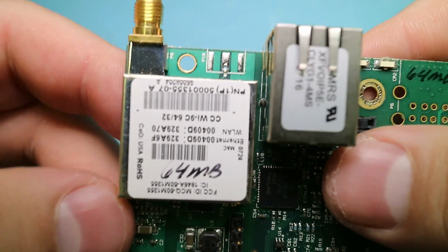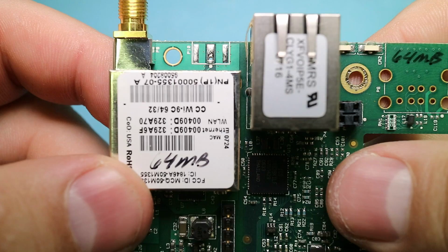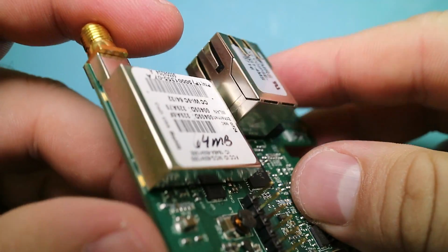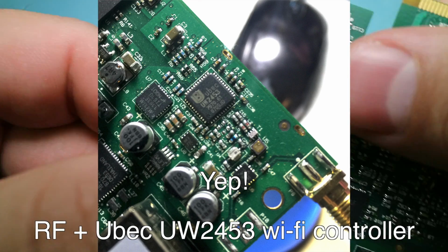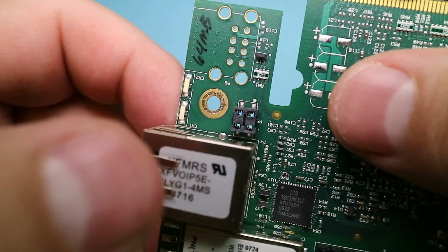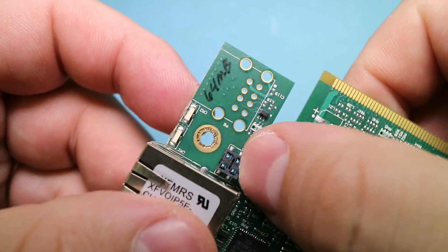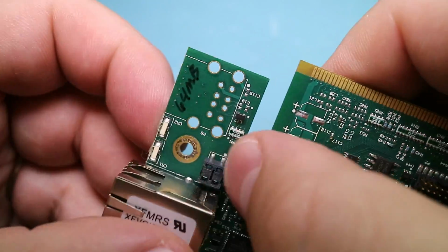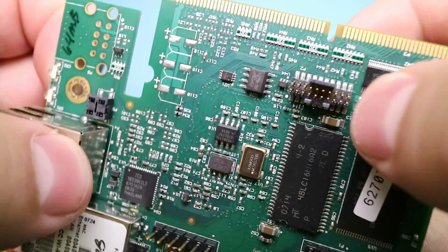The wireless module says 64 megabytes on it, so maybe this only has 64 megabytes of memory, but it looks like a little self-contained module with all the RF stuff in it. And that, I think, is just stuff to do with the magnetics for the Ethernet port. Got a couple small pin headers here, not really sure what that's for. And another little one here.